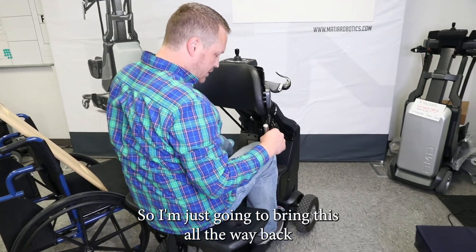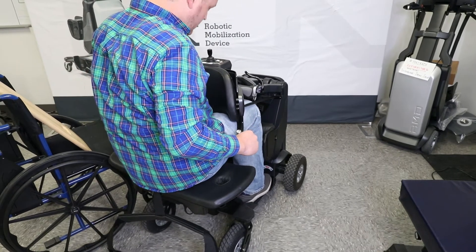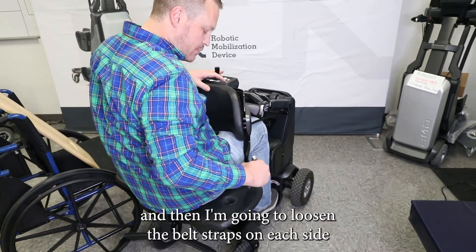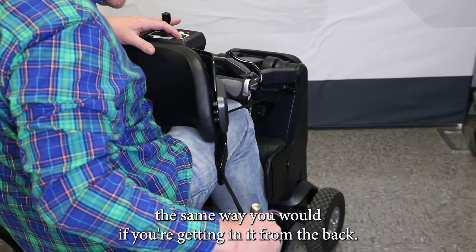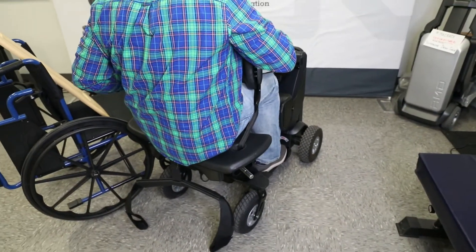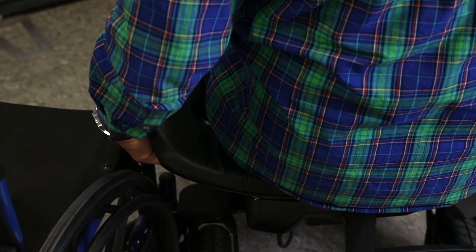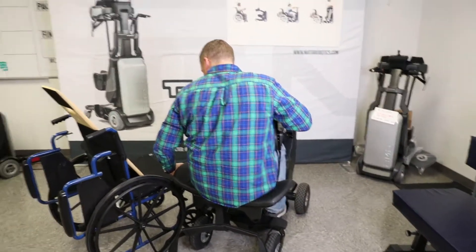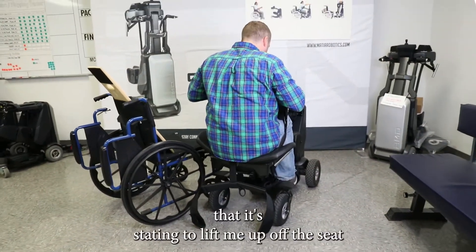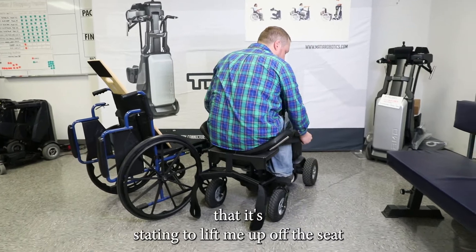I'm just going to bring this all the way back where it's nice and snug. Then I'm going to loosen the belt straps on each side, the same way you would if you're getting in from the back. Send those through the holes, and I'll tighten those up just the same as I always would, to the point that they're starting to lift me up off the seat.